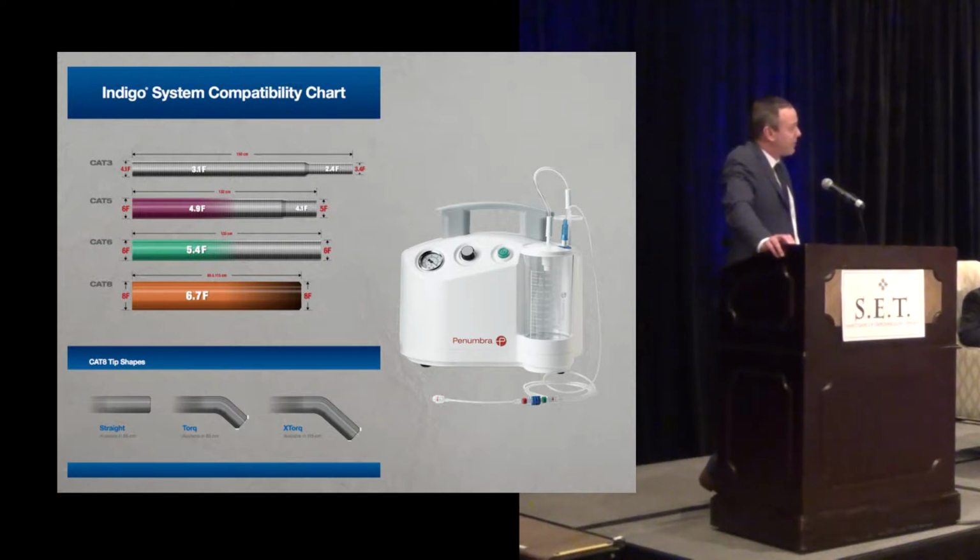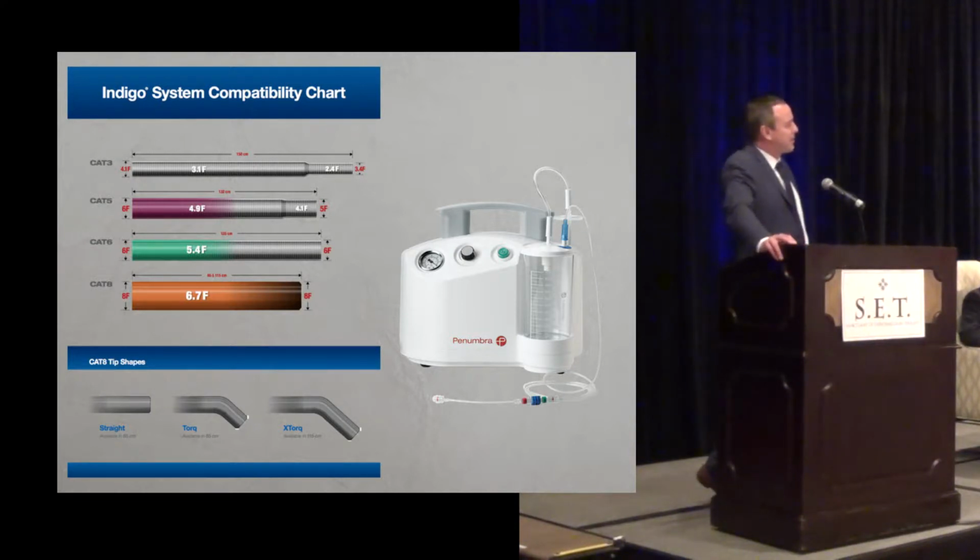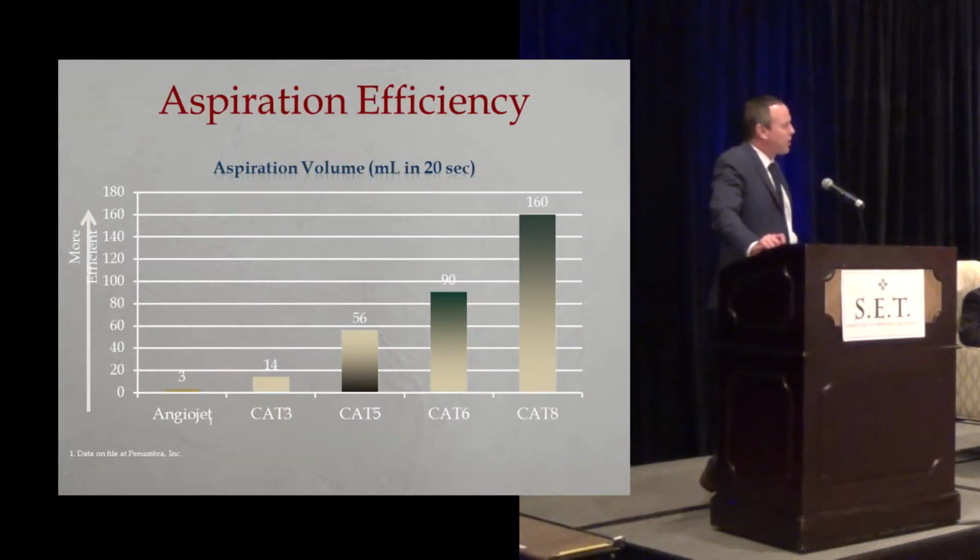The catheter lengths vary based on the catheter that you're utilizing. The Cat 3 will be the longest, right at 150, and the Cat 8 is right about 90 centimeters. They also have a 115, and I think the straight goes up to 135. It's a relatively straightforward catheter to use, and the aspiration system itself is quite easy to utilize. It's also quite easy to set up and to transport throughout the hospital. It's really just a direct tube that goes on the sheath itself via tubing between the 2 systems.